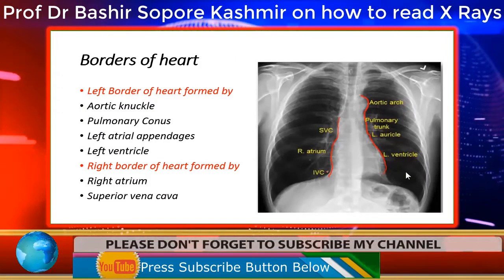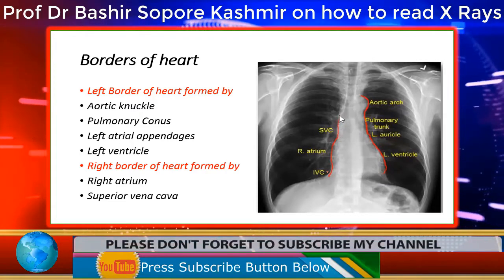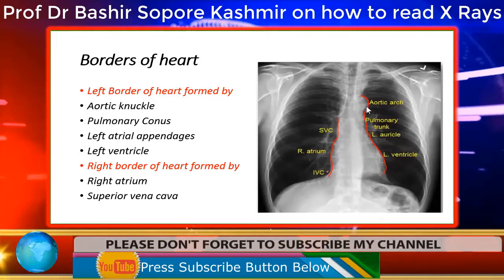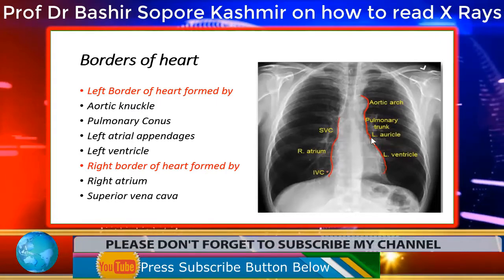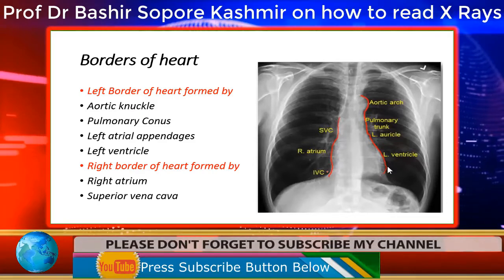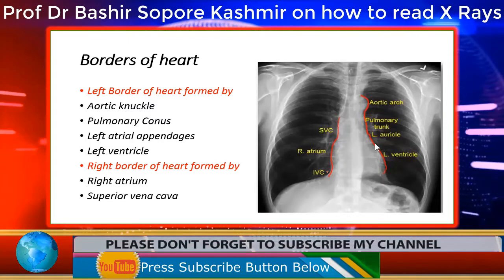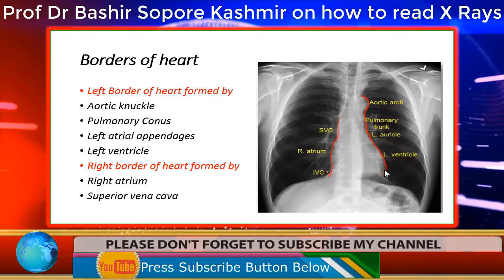Now, as I said in the previous image, the borders of the heart are the superior vena cava, right atrium, and inferior vena cava on the right side. And on the left side, it is the aortic knuckle, the main pulmonary artery or trunk, the left atrium and the left ventricle. But practically, when we have to talk about the right border of the heart, we only speak about the right atrium. And if we have to speak about the left border of the heart, we speak only about the left ventricle.